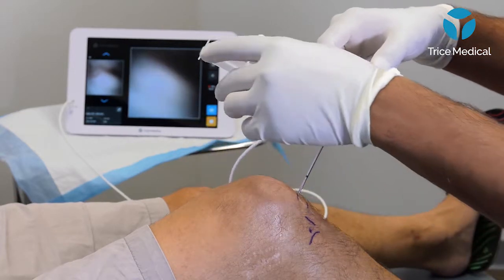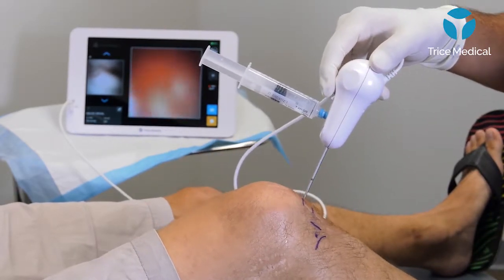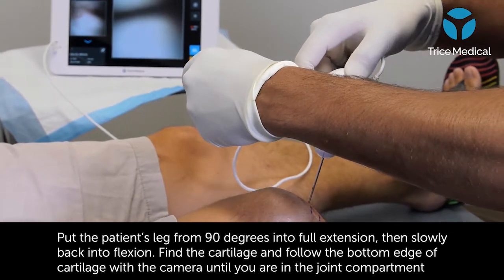What I'll do is take this point of reference and extend the knee. Look at that — I fall right into the compartment.